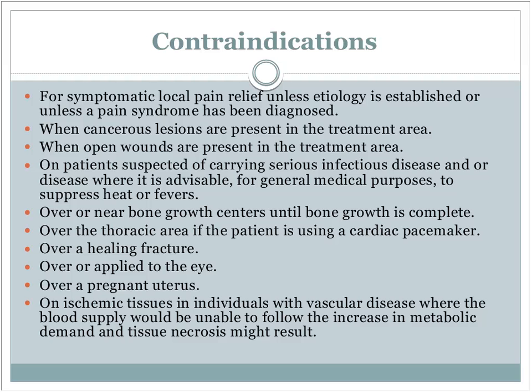We don't do this over bone growth centers because the bone growth, the epiphyseal plates, if they're not already fused, we can cause premature fusing. Now, we're not going to see that very much because that tends to be more in children and adolescents, which is not usually our patient population. But the same thing applies to healing fractures. We don't want to disrupt that healing fracture.